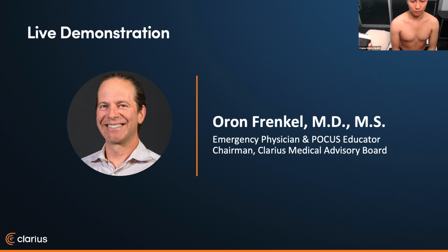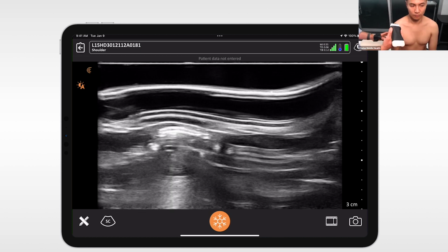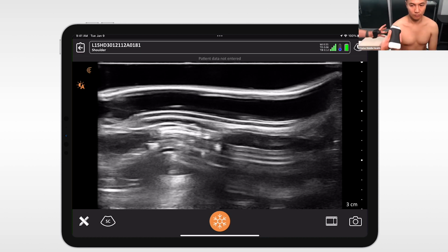So I'll take it through a couple of the basics as a quick maneuver, just to review some of the things you covered. Is that okay? Yeah, sure. Okay, so I've got here the L15 on a shoulder preset, and it's fired up.